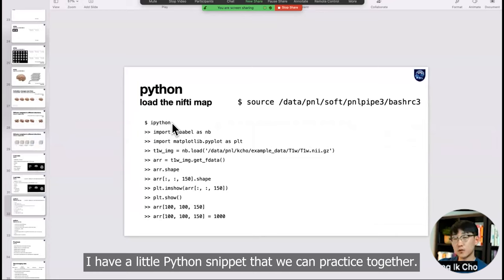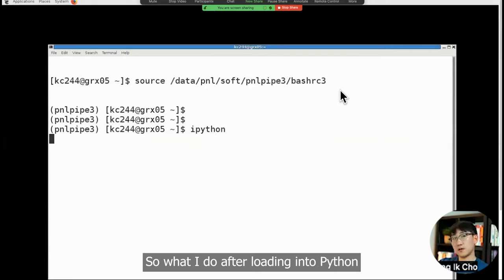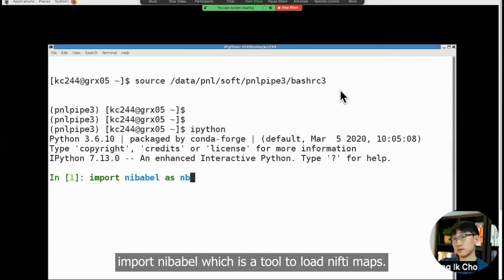Next, I have a little Python snippet that we can practice together. Once you source that, you'll be able to use PNL Python. So I'll just go to Python. What I do after loading into Python, I'm going to load the map just to show you that these are actual numbers. Import nibabel, which is a tool to load nifty maps.